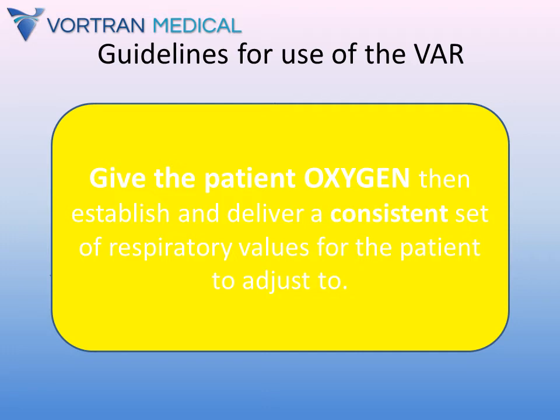When manually bagging a patient, you are unable to maintain a consistent minute volume, so you create a randomly moving set of values that the body has to constantly chase, causing our already compromised patient to deal with even more stress.